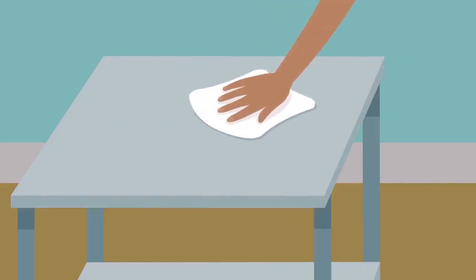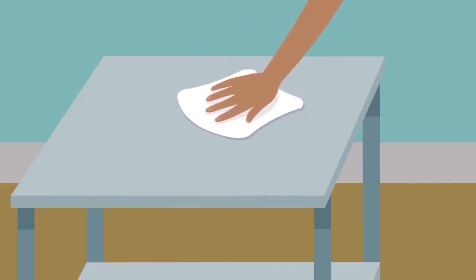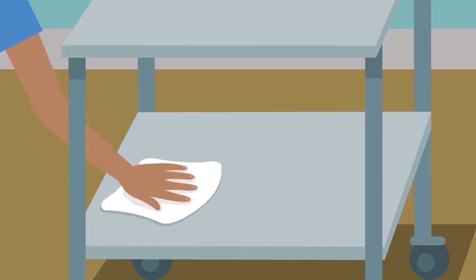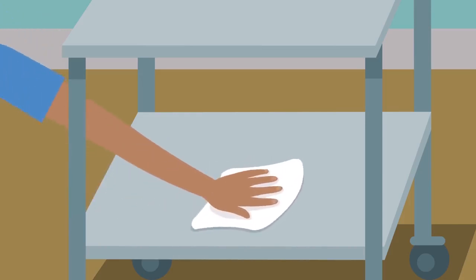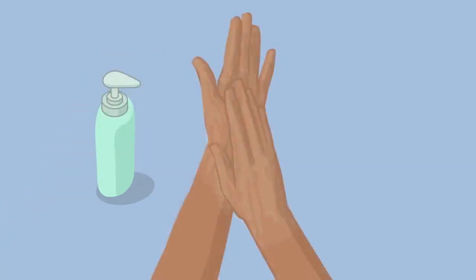The working table must be cleaned and disinfected using alcohol or another non-corrosive disinfectant. You may use ready-made wipes but do not use sprays. Perform hand hygiene before preparing the equipment.